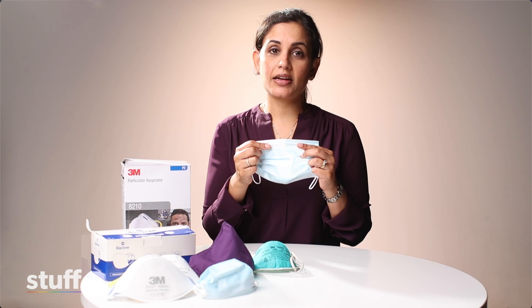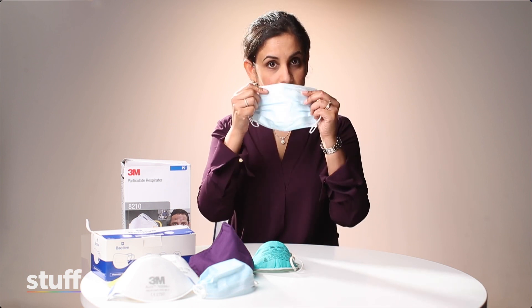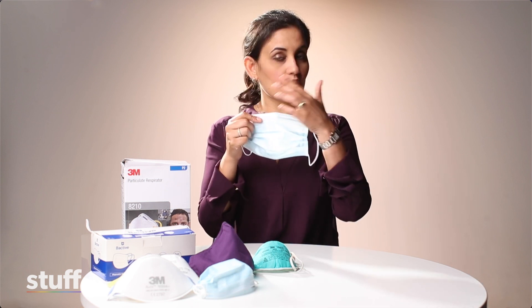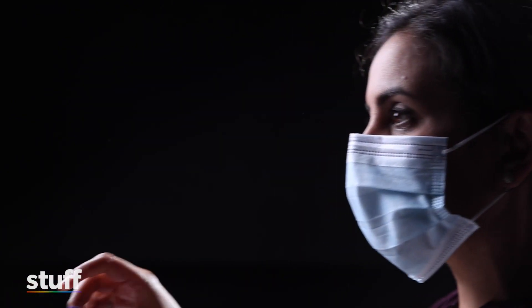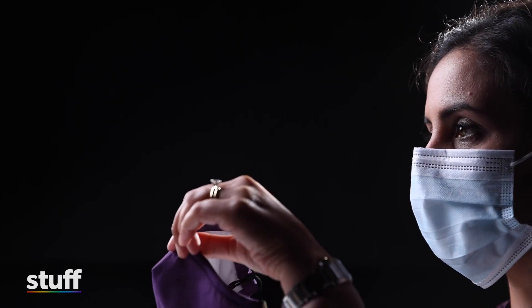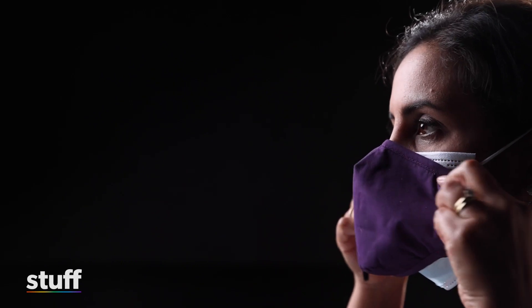The third mask hack I'm going to show you is improving the fit of your mask by double masking, or placing a cloth mask over the top of your surgical mask, which improves the fit and gets rid of leaks from the side and the top of the mask. So take your surgical mask and put it on. Then take a good cloth mask that has a nose wire and covers your chin, and pull it over the top.